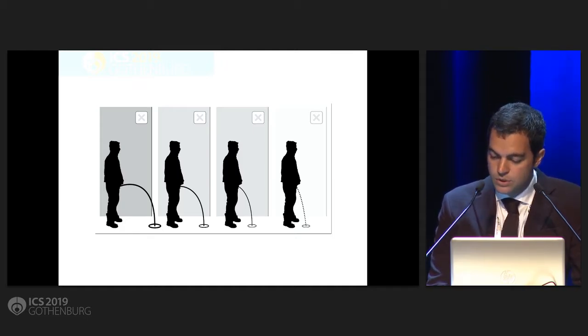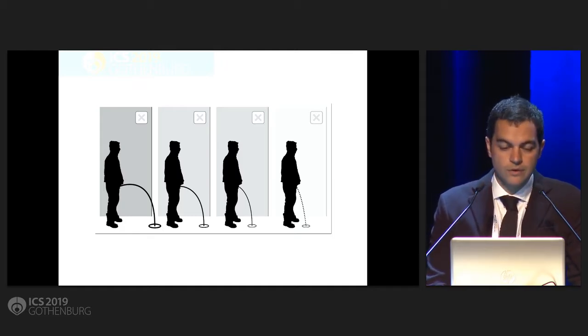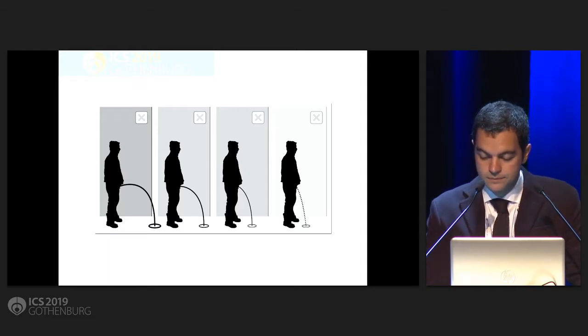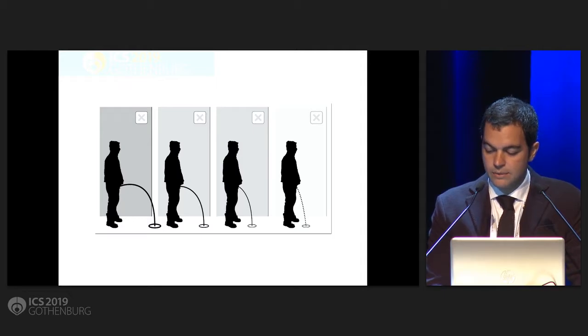For the first approach, and having in mind those clips I've just shown you, we configured this first 4-image pictogram representing 4 standing men in sagittal view with 4 decreasing urine streams. This first pilot image was assessed in 83 patients, and we found that 93% of patients selected the 2 central images.